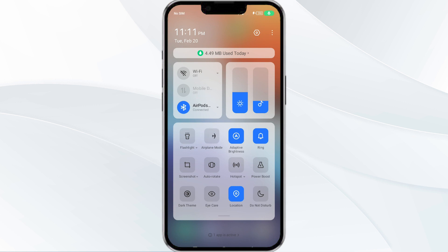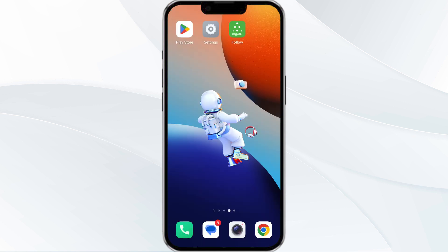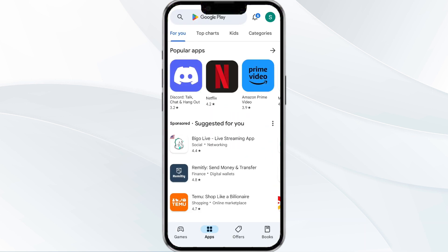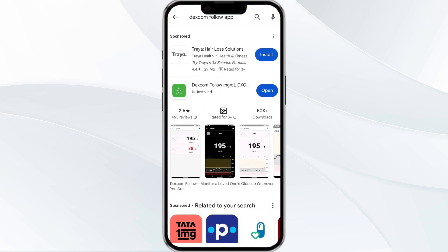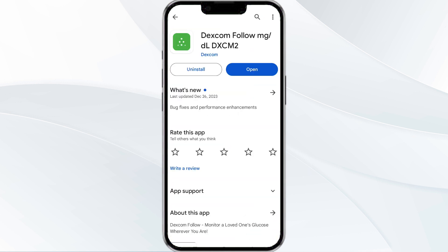The third method to overcome the problem is to update the Dexcom Follow app to the latest version. To do this, open the Google Play Store app and search for the Dexcom Follow app. Select the app, and if an update is available, you will see an option to update next to the app's name. Tap it to proceed, and once updated, relaunch the app.